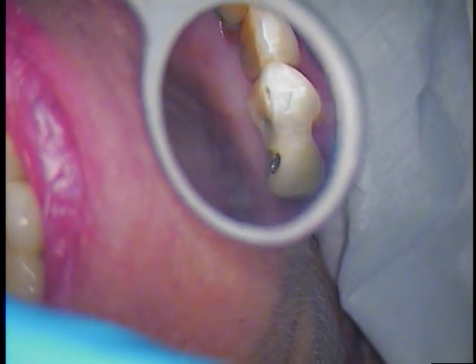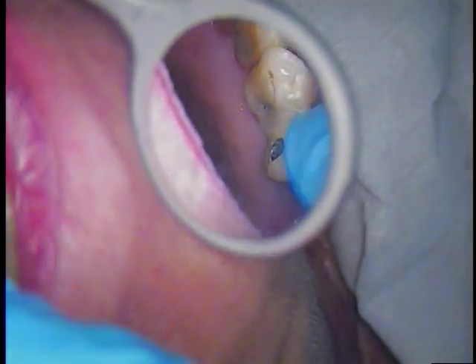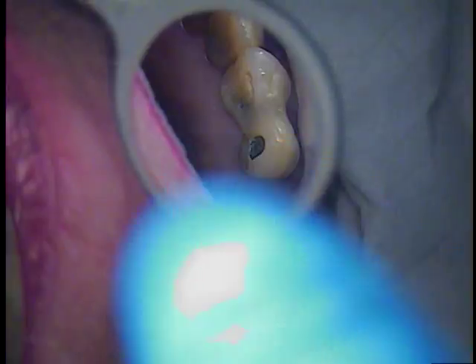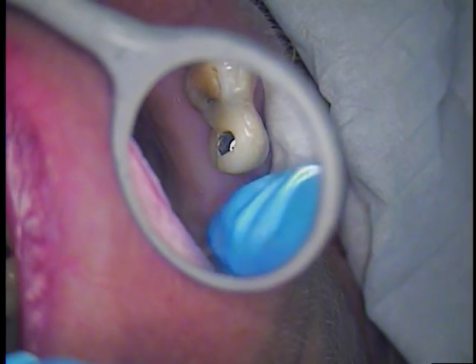The good news is we have a screw that is being retrieved — and that's good news. That's what hadn't been able to be done. So, I'm going to stop here. I'll come back on the next clip after I remove all this bonding. The bonding is just regular — A2 Charisma — we put it all the way around her tooth. She's very happy and satisfied with that, but we know that's not a long-term solution. Hopefully, we'll be able to retrieve that screw, put a new one in for her, and finish up today's job. Next clip.